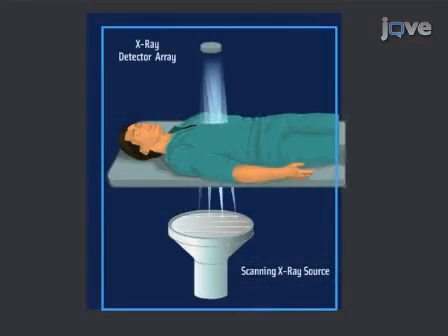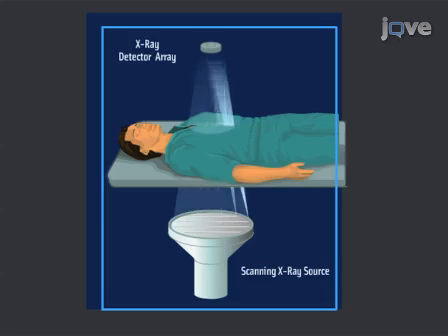We are developing an imaging system called the Scanning Beam Digital X-ray or SBDX system that enables inverse geometry X-ray fluoroscopy. The main difference between a conventional and an inverse geometry imaging system is that we are not using a single focus spot X-ray tube that projects onto a large field of view detector. Our X-ray source consists of thousands of focus spots, with each collimated onto a small photon counting detector.